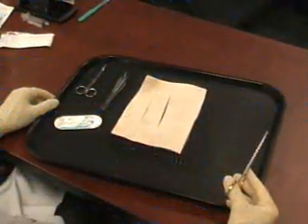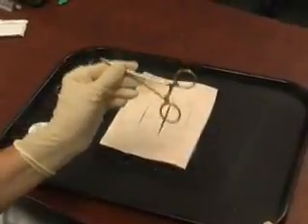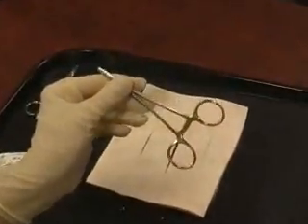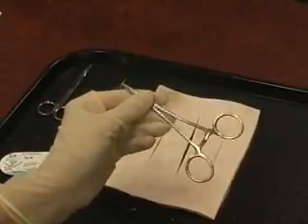Good afternoon, students. Today we're going to be talking a little bit about suturing technique. First thing that we're going to start with is to learn how to hold the needle driver or the needle holder. It's not a hemostat, it's a special instrument that's used to hold the needle.